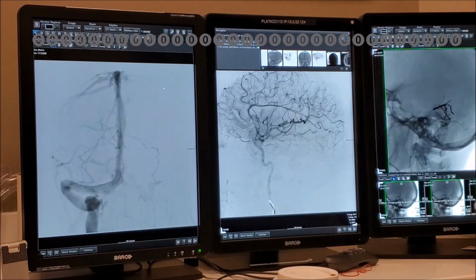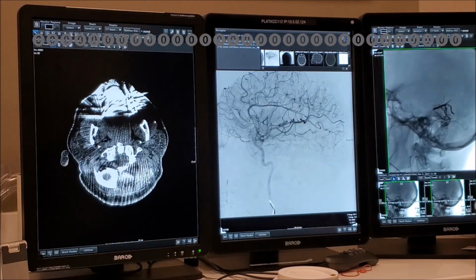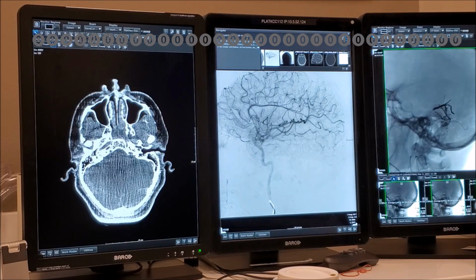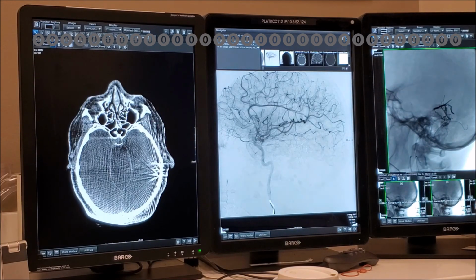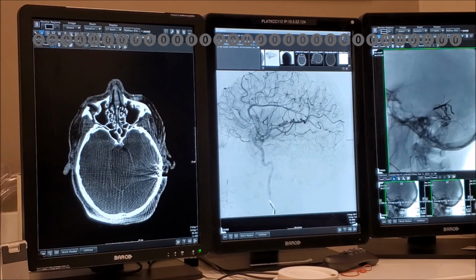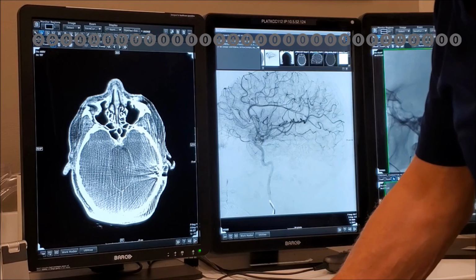And on the DynaCT, if you look, there's a non-contrast Dyna at the end to look at the Onyx cast distribution. Come all the way south. I think the tantalum separator was a little bit harder to see, but if you window that out to a bone level, do you mind if I window that for you? Yeah, all the way, and then maybe to the top left. Yeah, why don't you play with it?